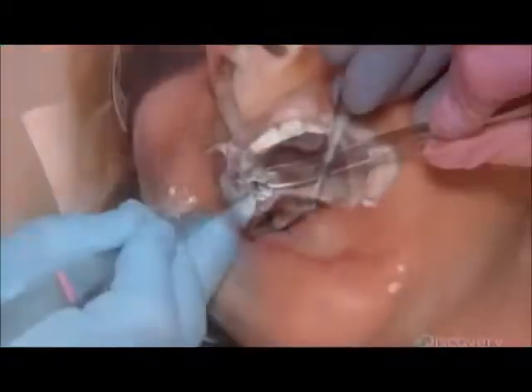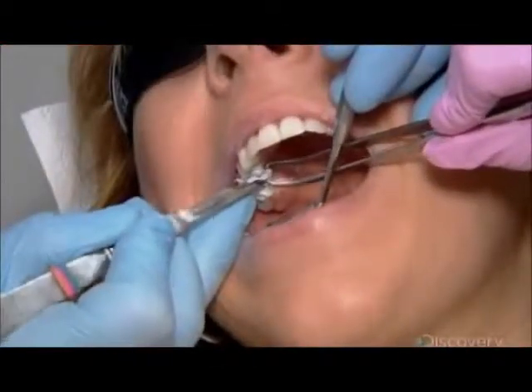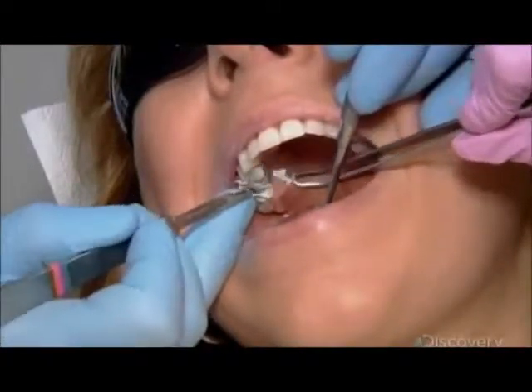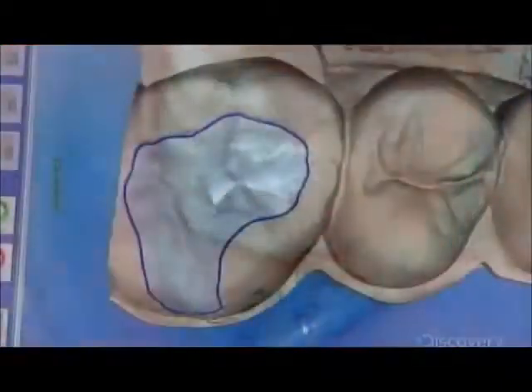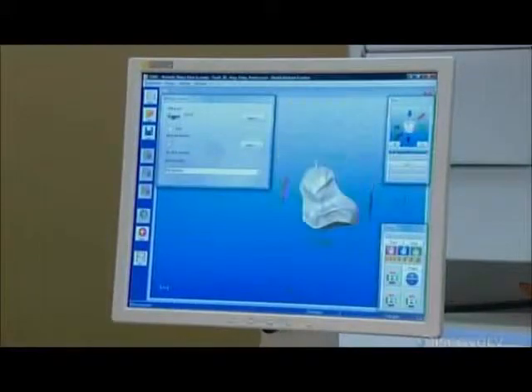Once the putty hardens, the dentist and his assistant chip off the excess. He downloads the image of the bite impression and then superimposes the images as he designs a custom dental inlay digitally.